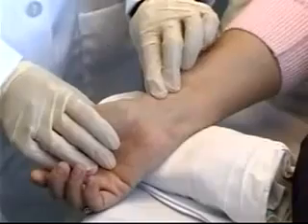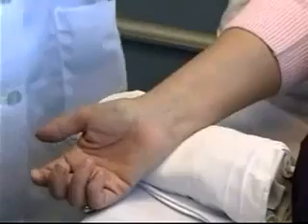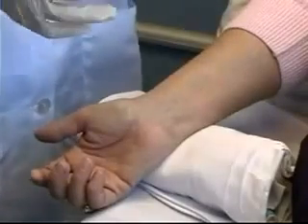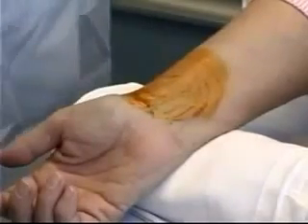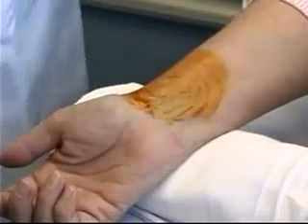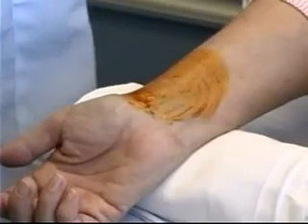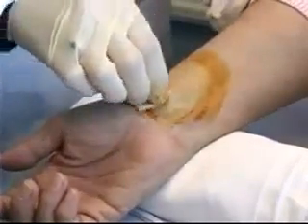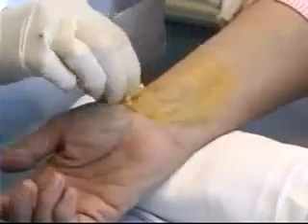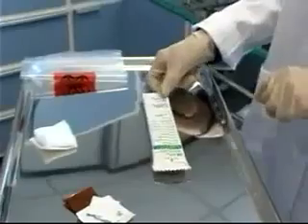I'm going to feel for the artery again — that's right there — and the first thing I need to do is clean the area. First cleaning is going to be with the povidone-iodine, starting in the middle and cleaning in a circular motion. After I've allowed that time to dry, my next step is to wipe away the povidone-iodine with an alcohol swab.